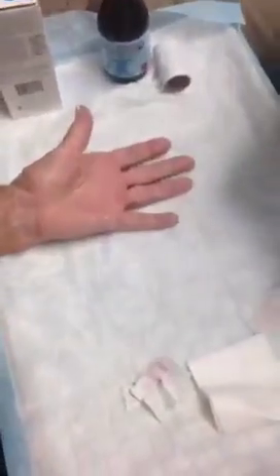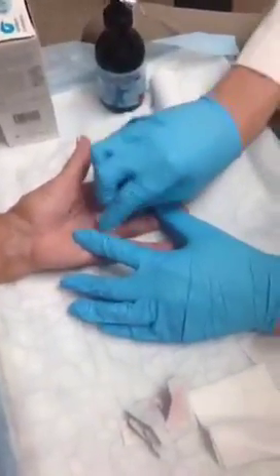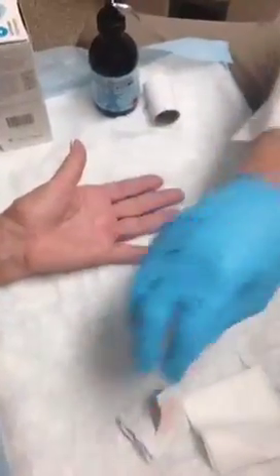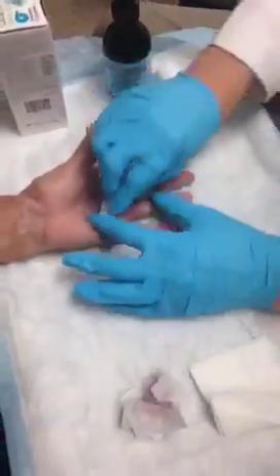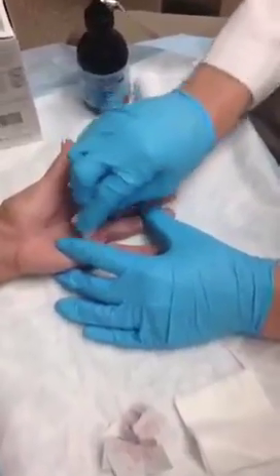I'll do that three times with isopropyl alcohol, not ethanol. Because we have lots of questions about ethanol — it isn't brandy. Lauren is asking if this will bring her instant relief. It will.